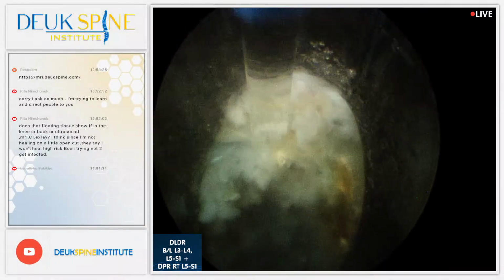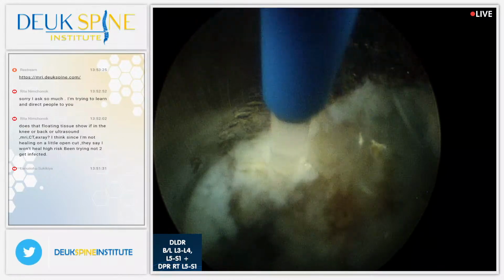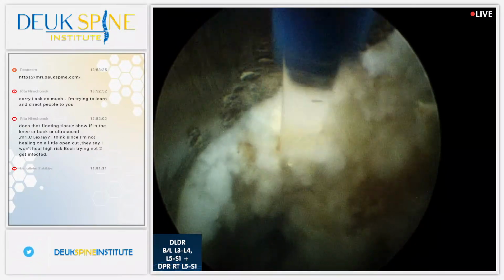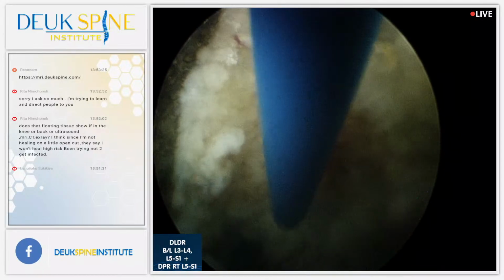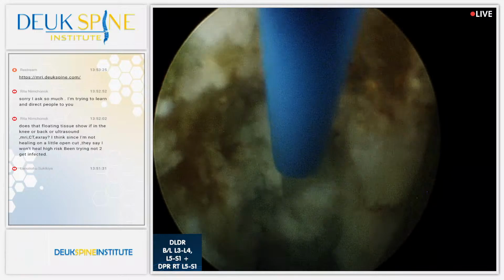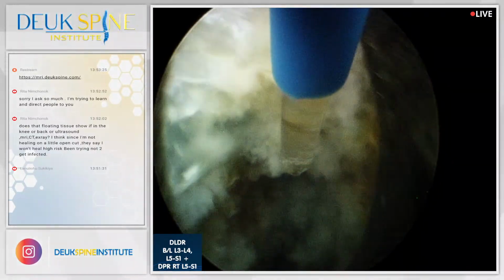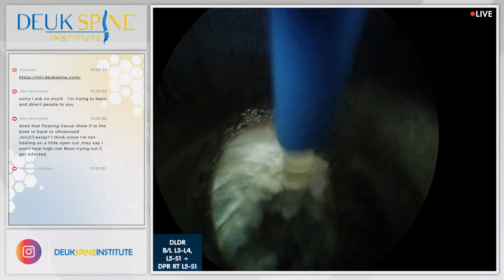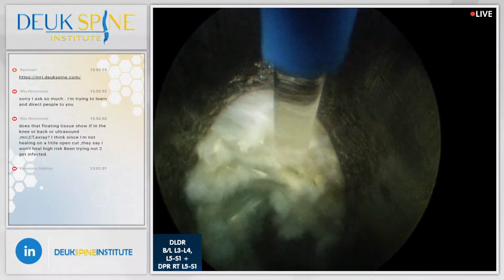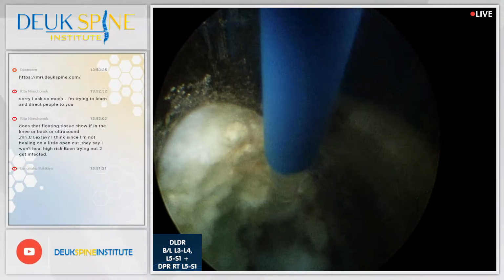It's easy to bend electromagnetic radiation using an optical fiber because you have different indexes of refraction for the different materials. But it can't bend electromagnetic radiation at 180 degrees. So a lot of it's going to come out the end, and that's what we want. So physicists and engineers have used these properties of physics to create such instruments that we can use in medicine.